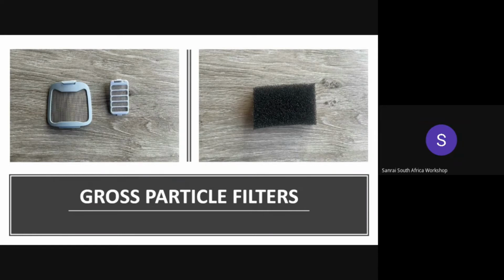The great thing about these filters is not only that they can capture particles, but they are also reusable. As much as they are reusable, they need to be well taken care of to prevent regular replacement. They would need to be replaced if they are broken or torn. A very important thing for users to know about these filters is that with every air intake, the contaminants trapped by these filters build up and eventually clog, and the result is a reduction of airflow into the machine. So these filters must be cleaned at least once or twice a week, depending on the environment where the machine is being operated.